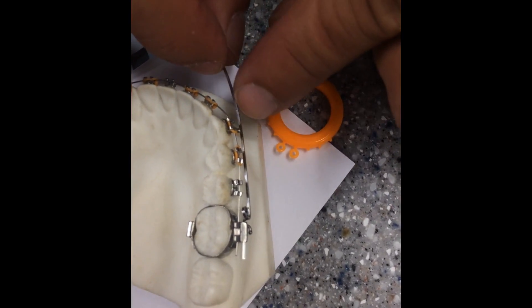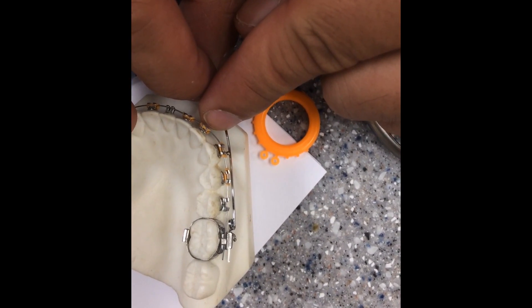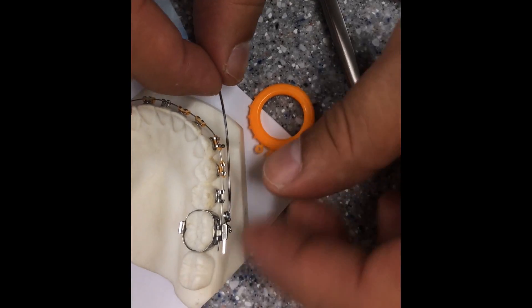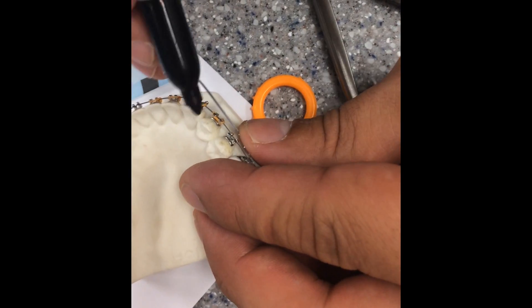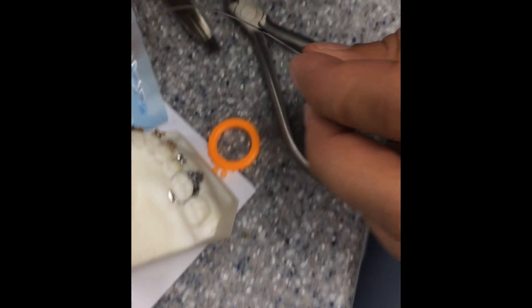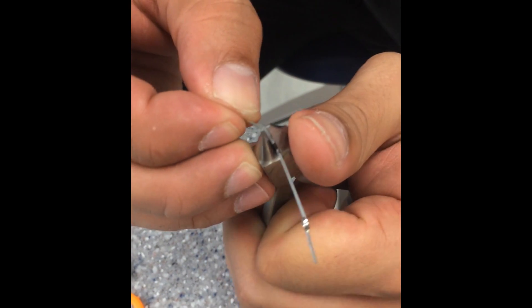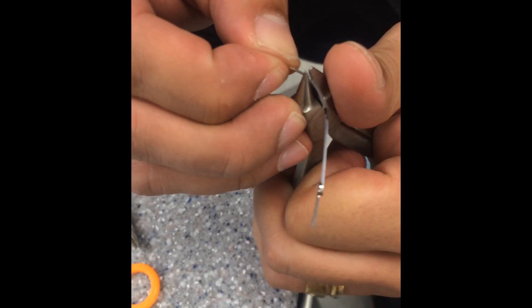So now we need to do a little curve here because this is going to hook between the canine and the lateral. So I'm sort of just marking around where I'm going to start the curvature. Then you can use one of those pliers that are appropriate for curvature, or you can do it yourself with this.